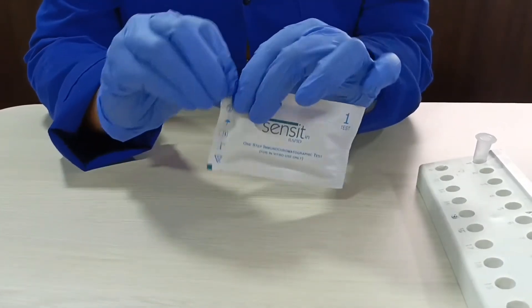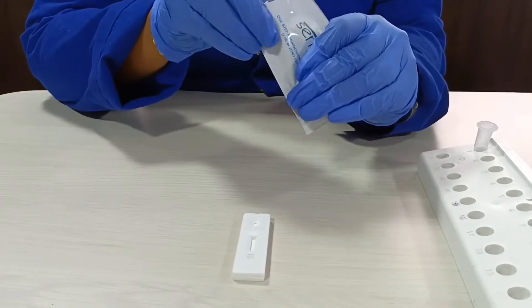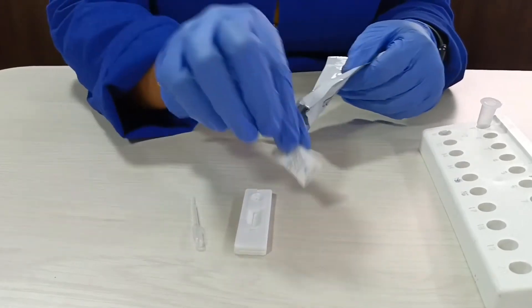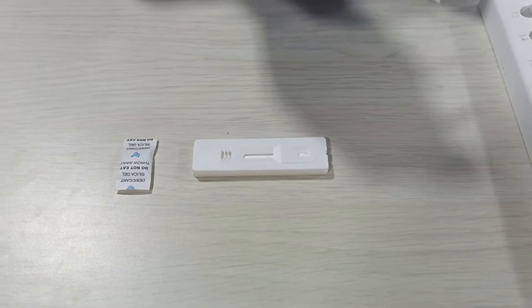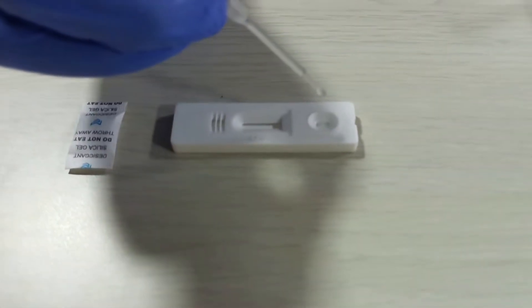Open the test device pouch. You will find a cassette, a dropper, and a desiccant. Using the dropper provided, add three drops of the extracted sample into the well marked S.